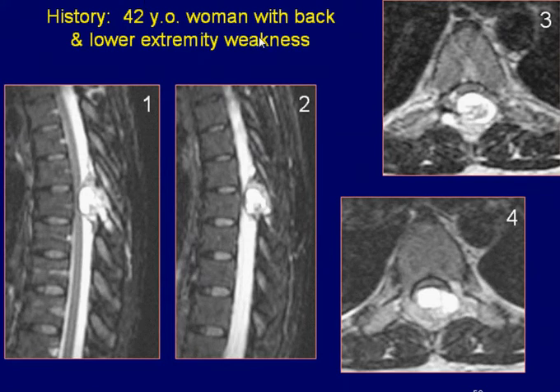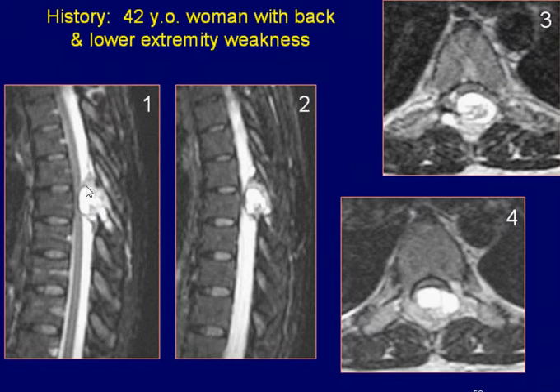A 42-year-old woman presenting with back and lower extremity weakness. Sagittal T2-weighted images of the dorsal spine reveal a high signal heterogeneous lesion at the posterior aspect of the spinal canal. The spinal cord at this level is compressed and displaced anteriorly by the lesion.